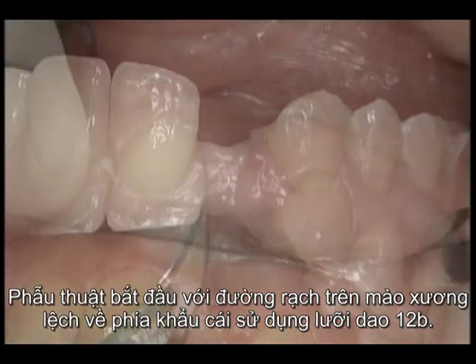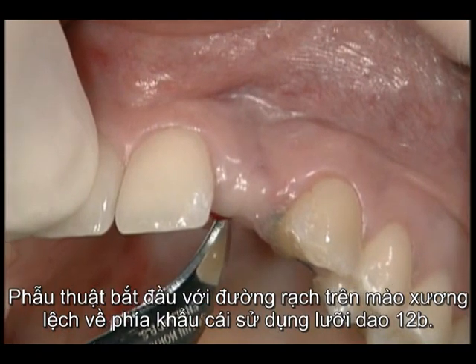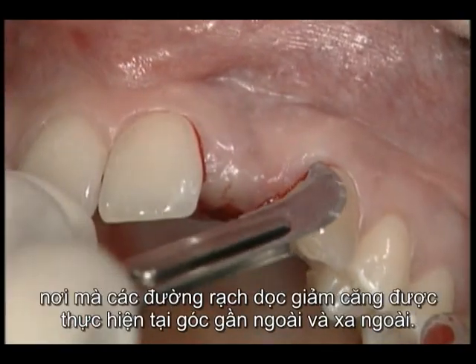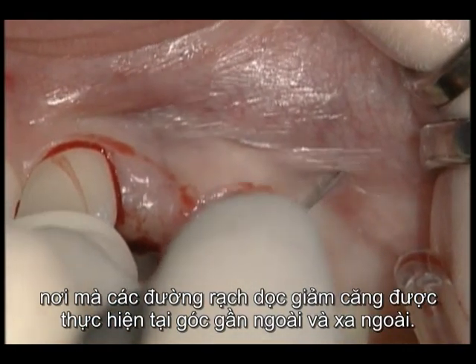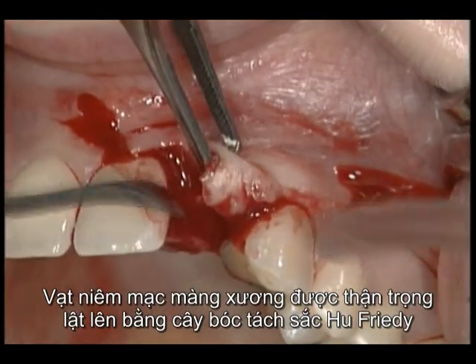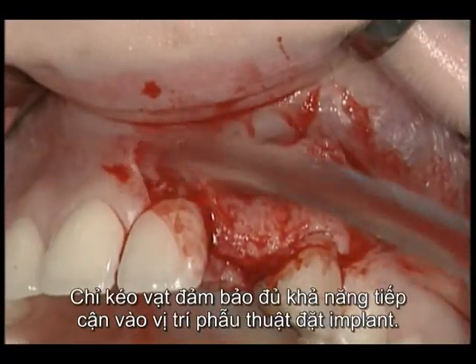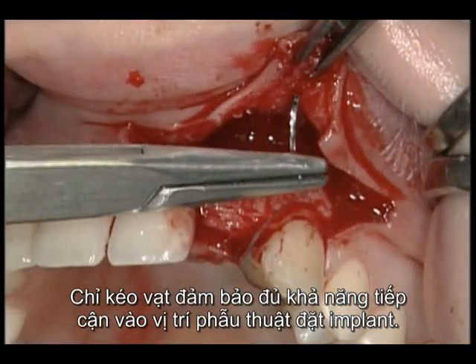The surgery begins with a palatal incision in the crestal area using a 12B blade. The incision is extended through the sulcus to the facial aspect of adjacent teeth, where vertical releasing incisions are made at the line angles. The mucoperiosteal flap is now carefully elevated using a fine Hugh-Freedy tissue elevator to expose the alveolar process beneath. A retraction suture in the flap ensures sufficient access to the implant surgical site.